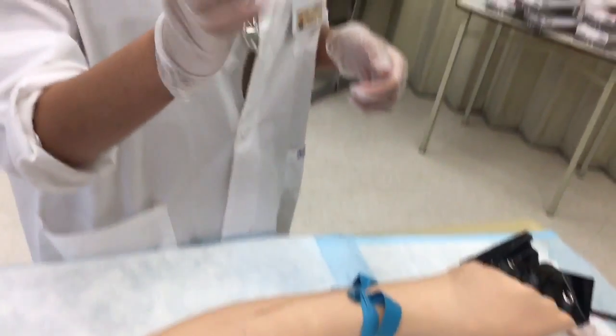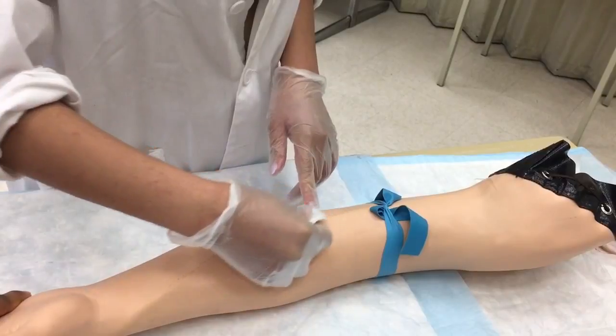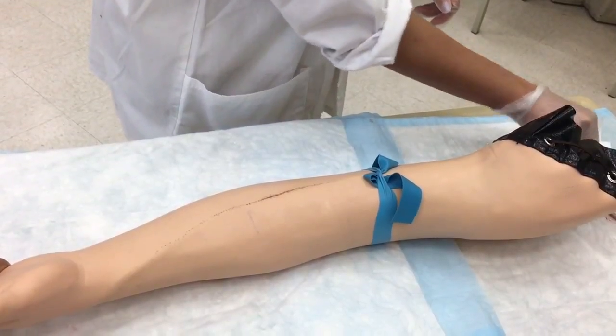I'm going to take my alcohol pad. I won't use it on the mannequin, but you would wipe going outward from the site. Then get rid of that, and now I'm ready.